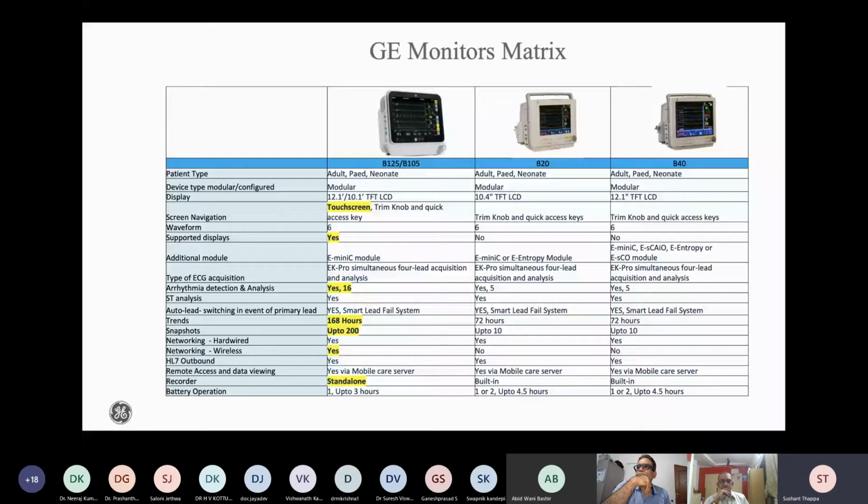Trim knob, you started with dash monitors, if somebody remembers. I remember very correctly because when I was there, we still were looking at solar and dash, and I don't know. I've recently seen a 20-year-old HP monitor, sir. So it's still there, I think, but we're moving in a direction where most of the monitors now have digital outputs, and they look at advanced parameters as well as advanced input areas.